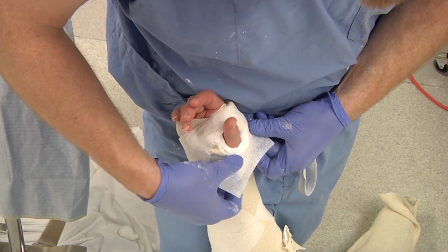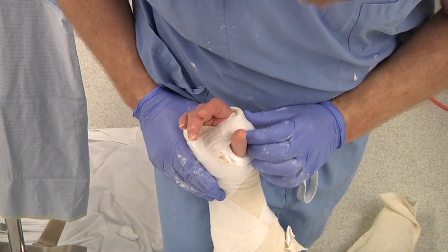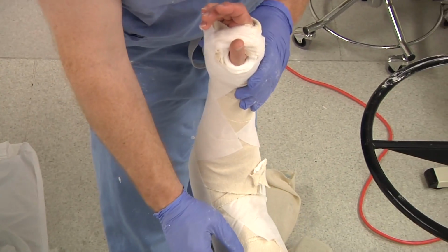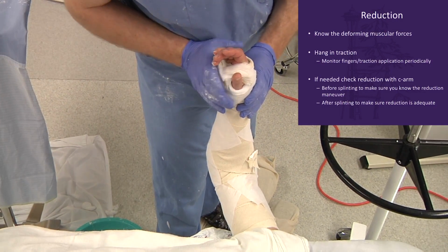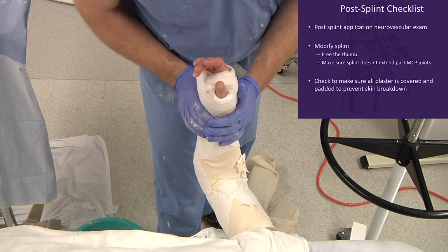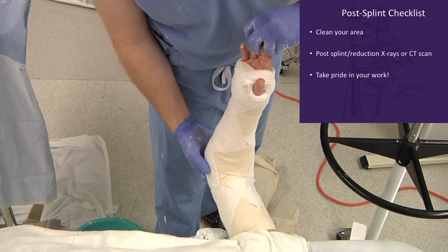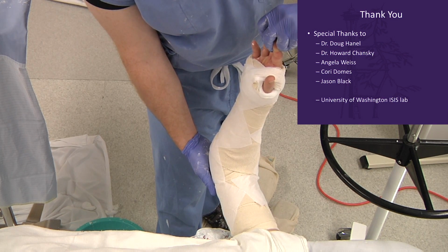And some tape. Afterwards, always check the top and bottom of your splints to make sure that there's nothing pointy or sharp that can dig into the patient and cause skin irritation or ulcerations. There is a long arm splint.